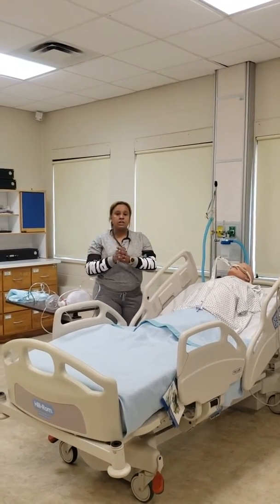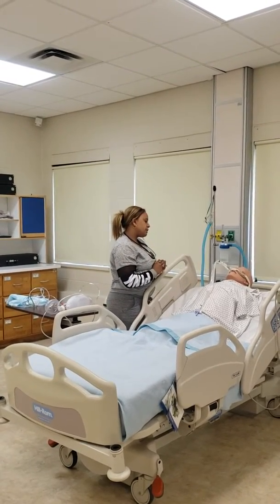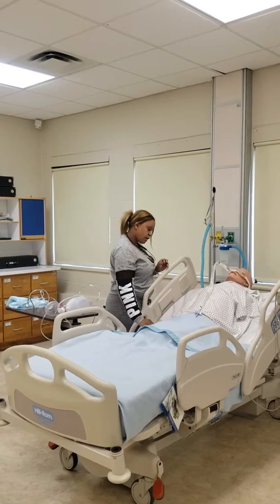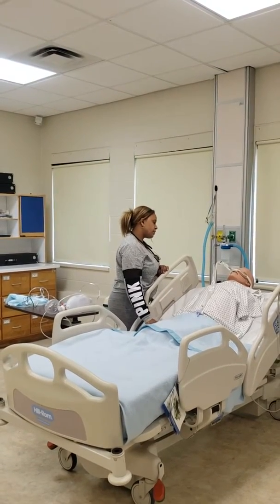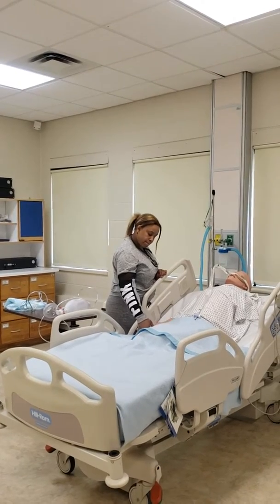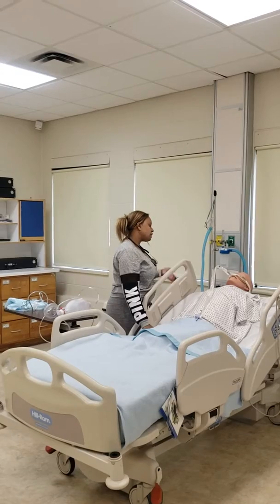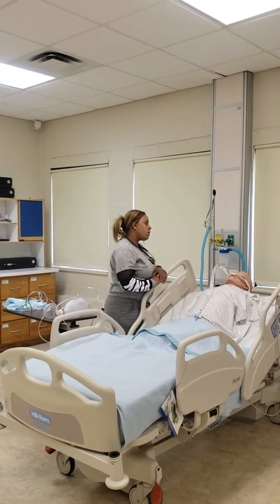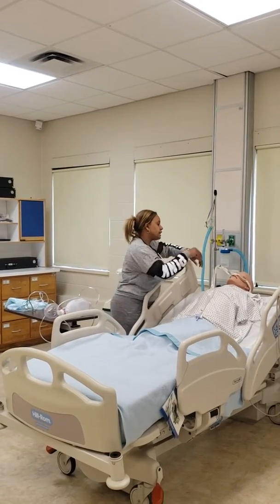I will now wash my hands for at least 15 seconds. Hi, my name is Tanika. I'm from Respiratory Care. May I please have your name and date of birth? Okay. So today I'm going to be suctioning you and removing your tube, okay? If that's okay with you, can you please squeeze my hand? While I'm suctioning you, I'm going to ask you to take in a nice deep breath, okay?